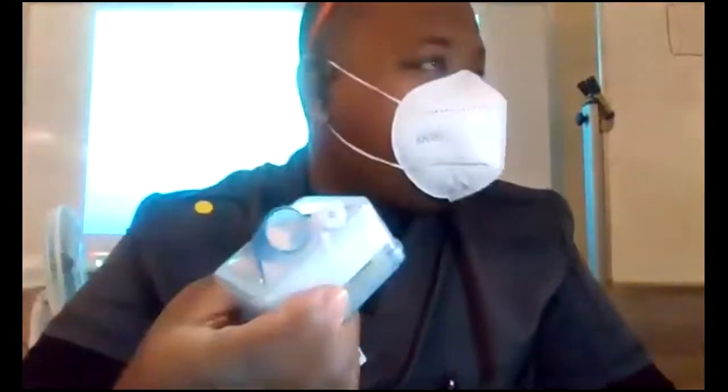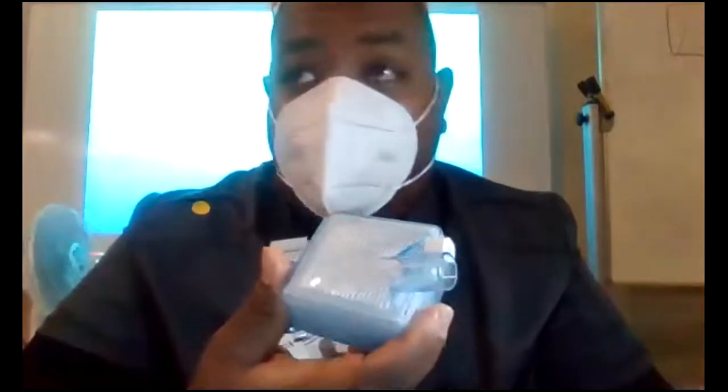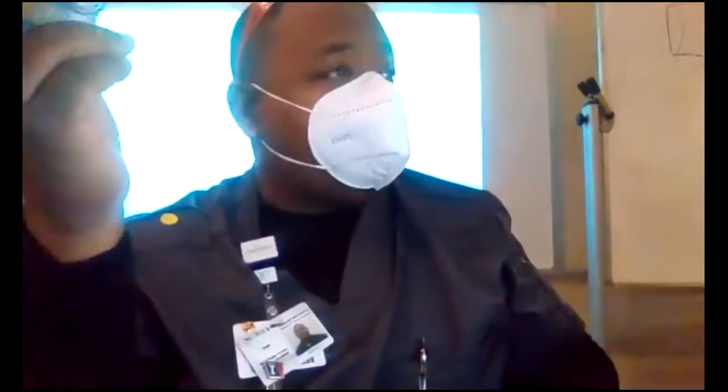This is a temporary humidifier. If you're only going to be on the vent for a couple of hours for a surgery or something like that, they will put you on this instead of wasting one of these water bags, because you're not going to use all of that. You're going to be off the vent by the time that's halfway done. So it's a waste. They just use one of these, it's one-time use, toss it.